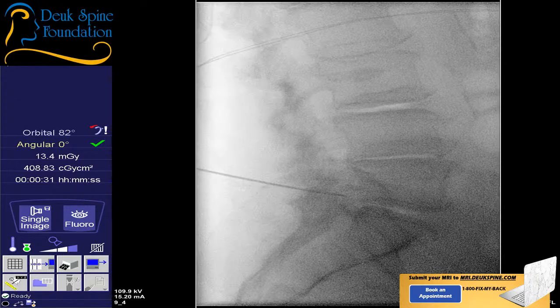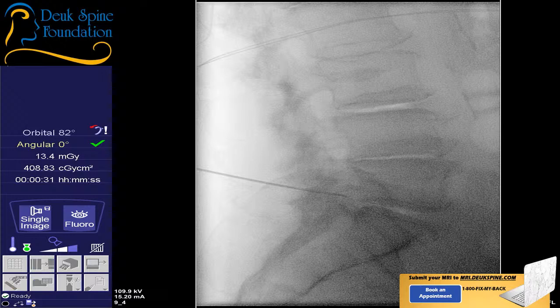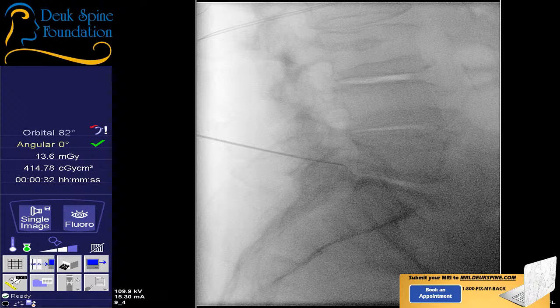All right, before I change my position, I want to do a little wagging myself and see what I can come up with. Shot with just about 1 degree. Do you think that's better or worse, Luis? Yeah, I agree. Just look at the L5. I think S1's better. I think I'll leave it. Lock it. I'll take it.